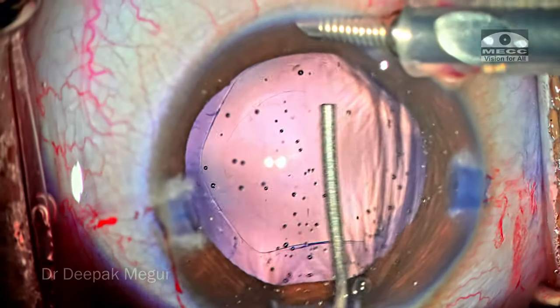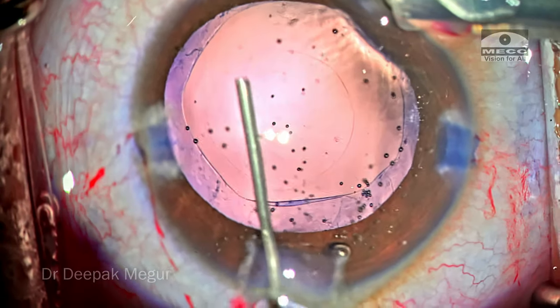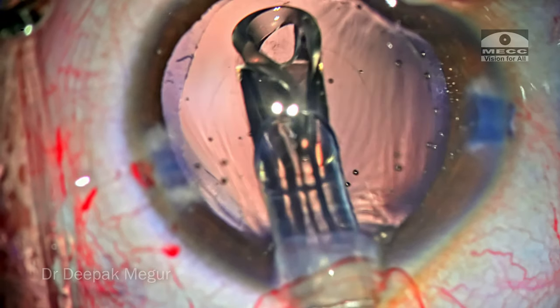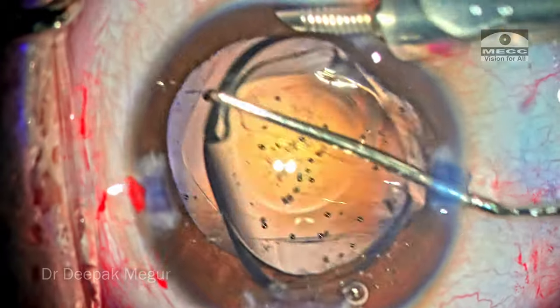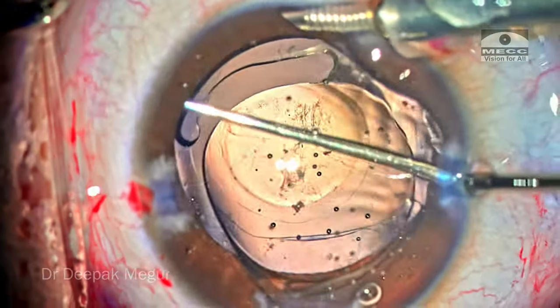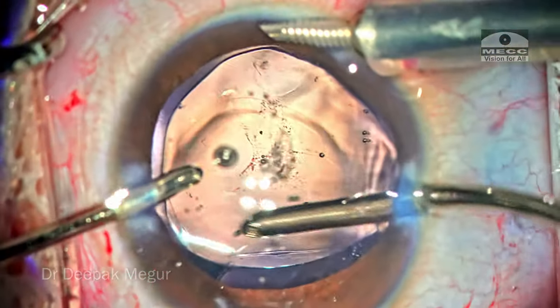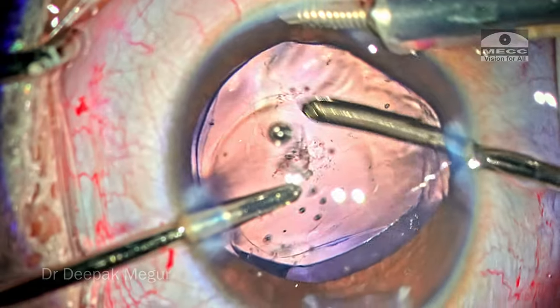Before doing vitrectomy, I always prefer to place the lens first into the bag and then perform vitrectomy. The planned single-piece intraocular lens is being implanted into the eye. We've under-corrected the eye's IOL power by about 2 diopters, keeping in mind the future growth of the eyeball and the myopia which can come into play as the eyeball grows.